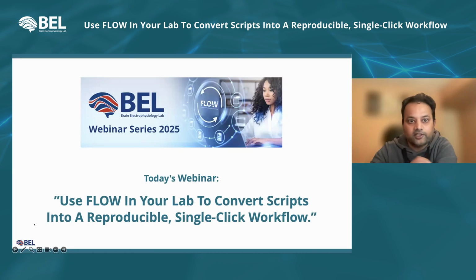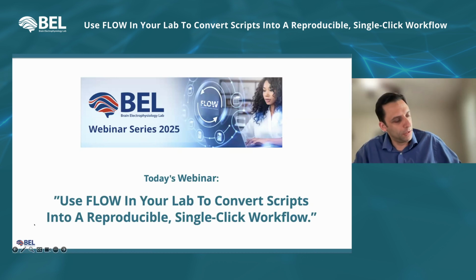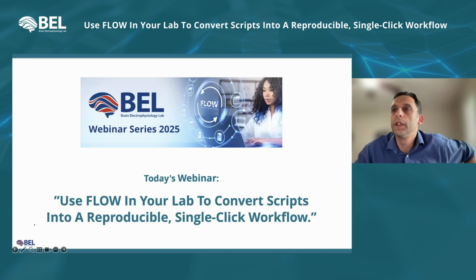And Roma, can you share your quick thoughts on how we're making collaboration easy, particularly for remote labs, with shareable workflows and whatnot, maybe at a very high level? So Flow supports a few types of accounts.